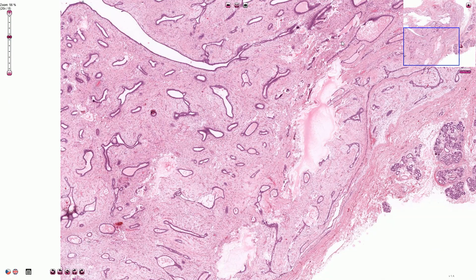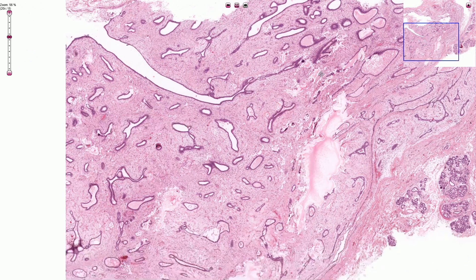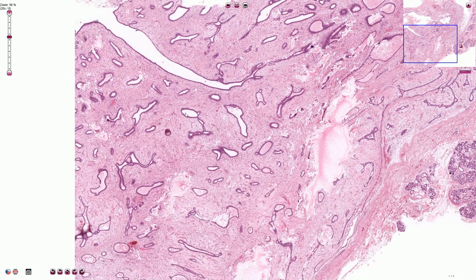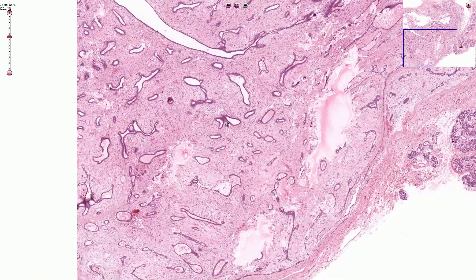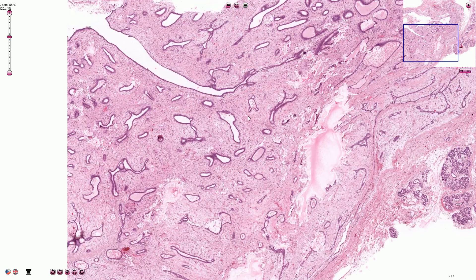Some ducts can be cystically dilated, as can be seen here, and that is quite common. Sometimes we can also see sclerosing adenosis, epithelial calcifications, or papillary apocrine changes. When we recognize these changes, we can diagnose a complex fibroadenoma, and those complex fibroadenomas are associated with a very slightly increased risk of carcinoma in the breast.